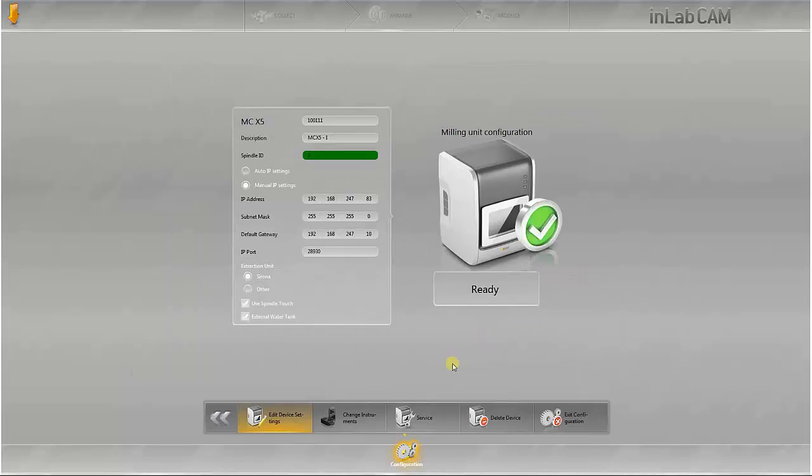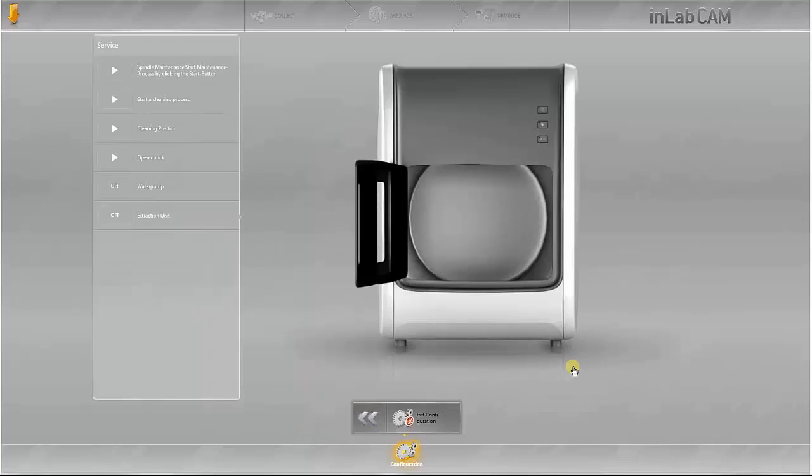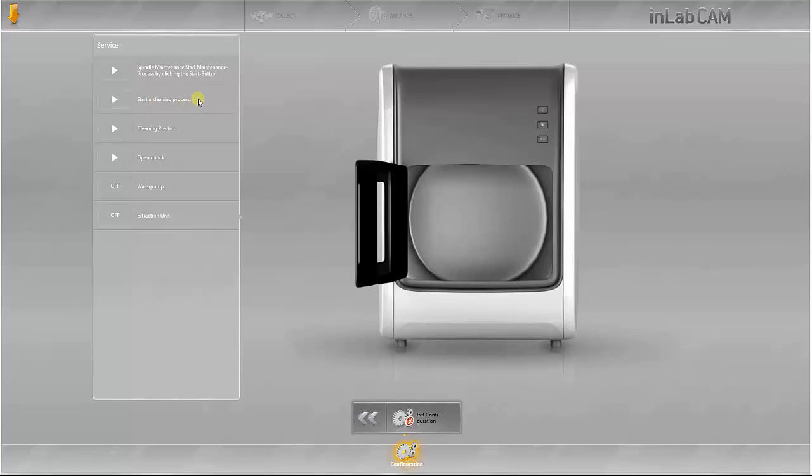All the service programs are integrated directly in the InLab CAM software and can be called up here. Various service programs can be started here. Spindle maintenance, the automatic cleaning process for the blank holder and the tool holder.